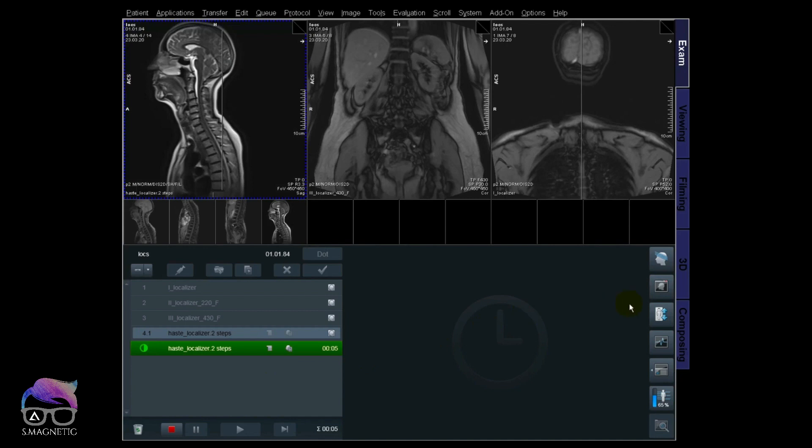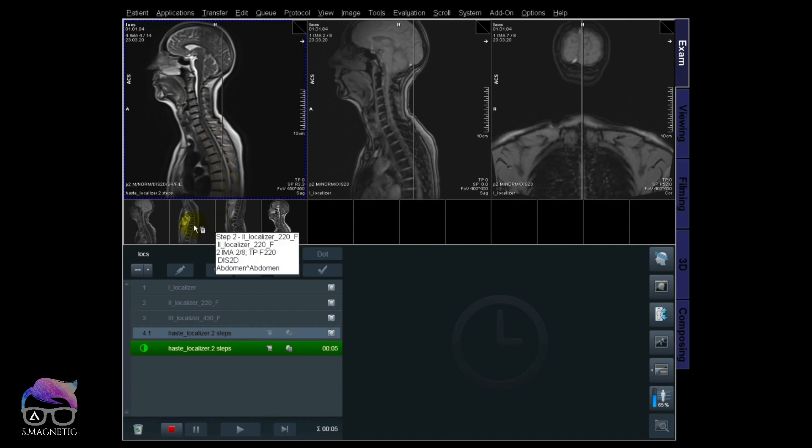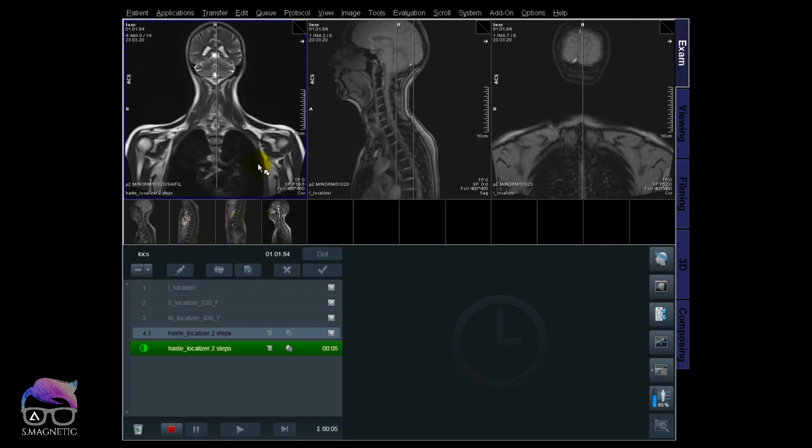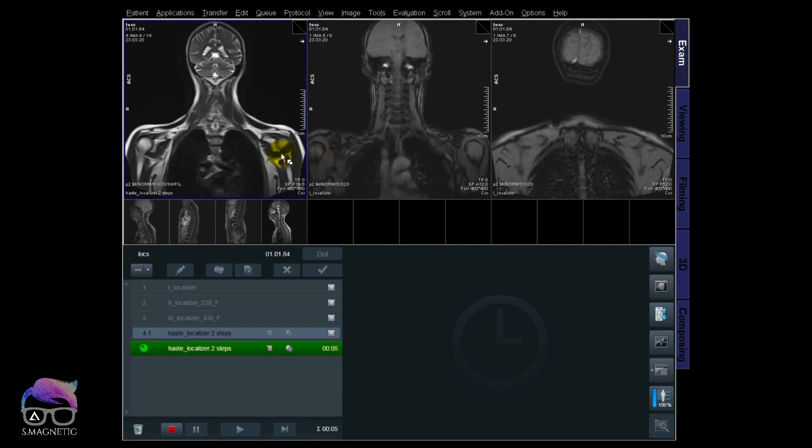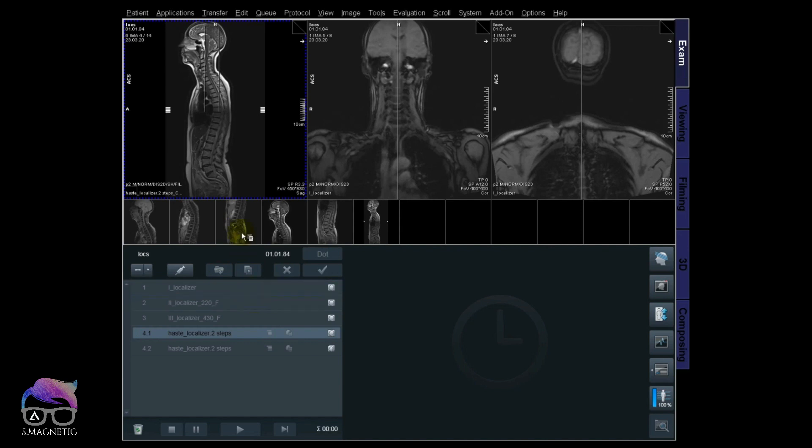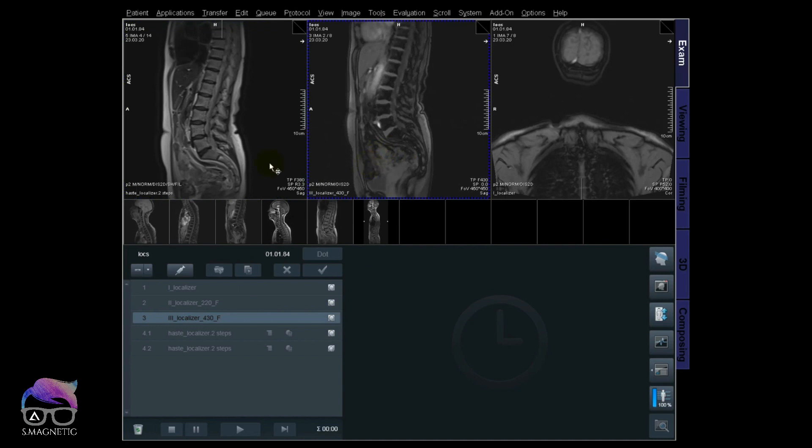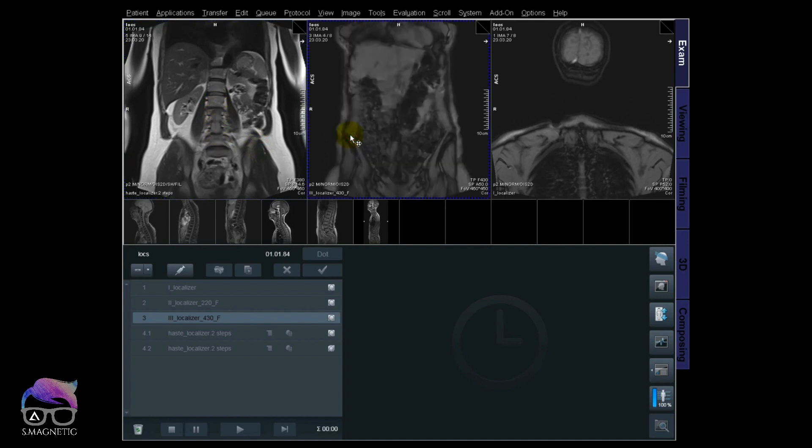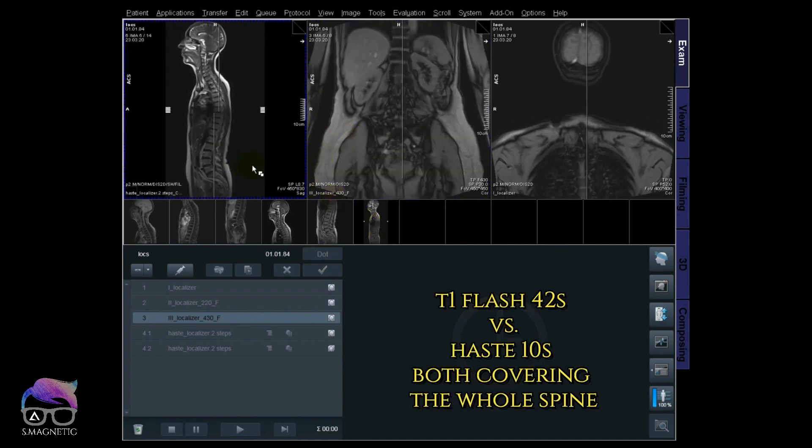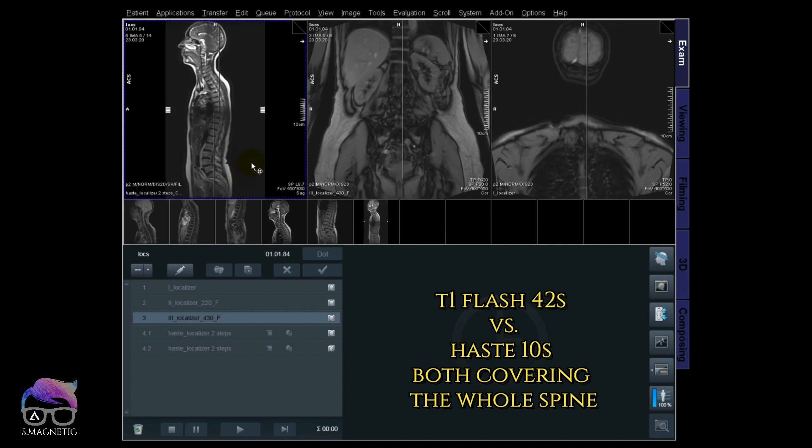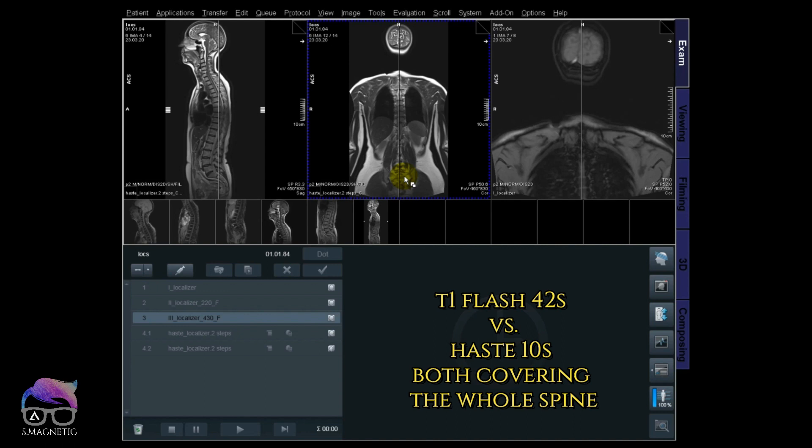So let's go for step one, that's the cervical half of the thoracic part, two planes just like the original T1 flash from Siemens, and we have it in two planes as well. So I see what I need to see to do the planning, it's not that bad for five seconds. Let's check the lumbar part there and compare it to the T1 flash, you see what you've got to see. And then I have the composing, automatic composing on, two planes, sagittal and coronal, just to get a great overview when now I'm doing the planning of the total spine.